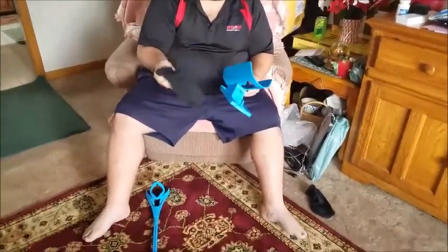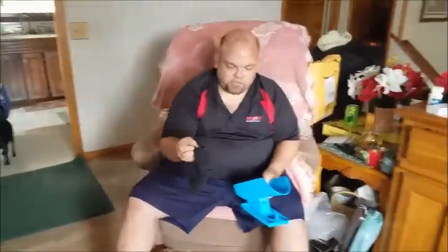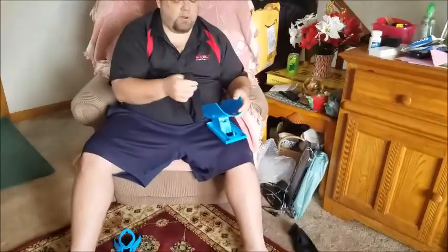I'm going to show you how to use the sock slider. It's very easy to do. As you can see here, I've got my sock slider device. I've got my sock. It's for those individuals who can't bend over and put the socks on themselves for whatever reasons.